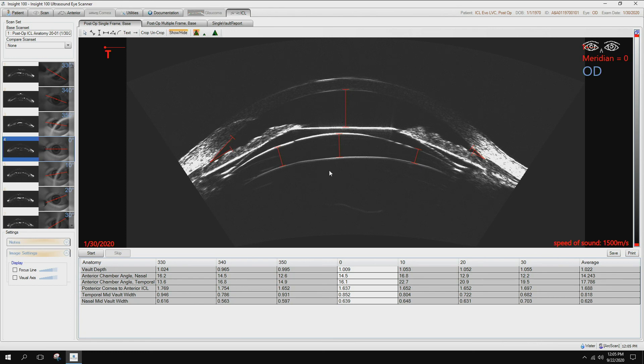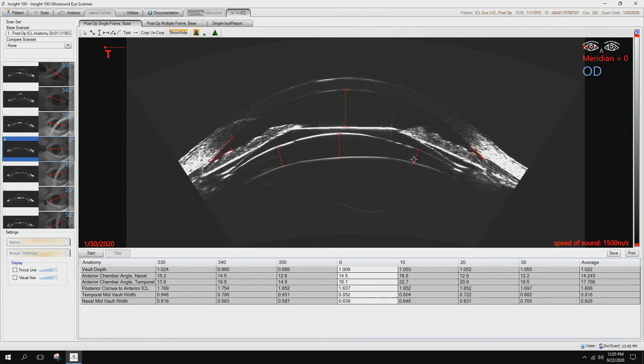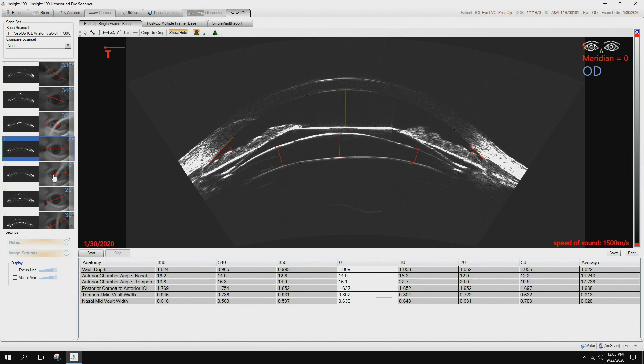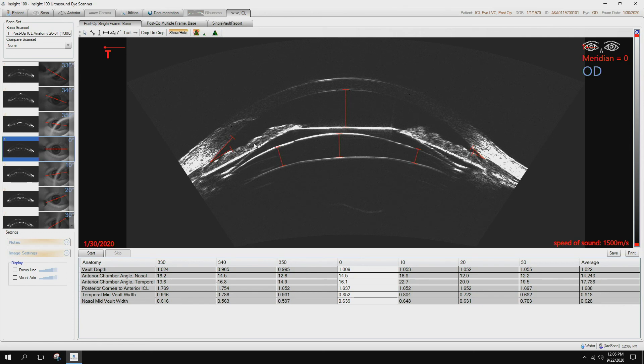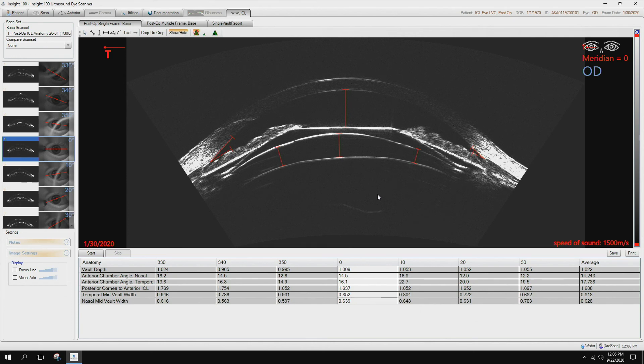So with that, that is pre-op measurements, and here's a post-op image to validate just what your vaults are and how that lens is sitting in the eye. You can look at multiple meridians to make sure that the footplates are not resting on a cyst, and if you needed to make an adjustment to the lens, you could simply come back in through your incision, readjust the footplates, and now your vault and your lens is sitting correctly as you had planned. With that, that is the ICL pre-op and post-op measurements on the Insight 100.